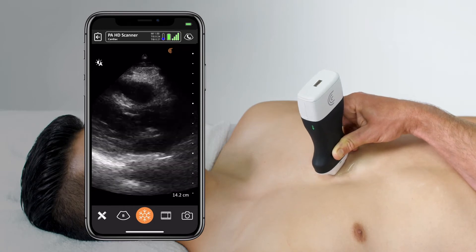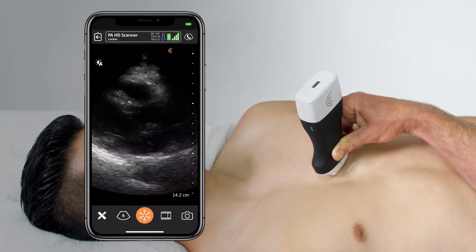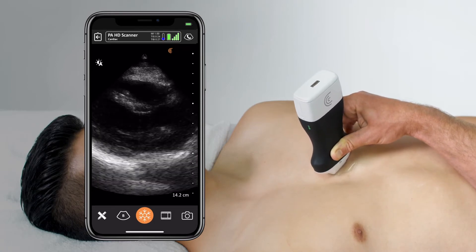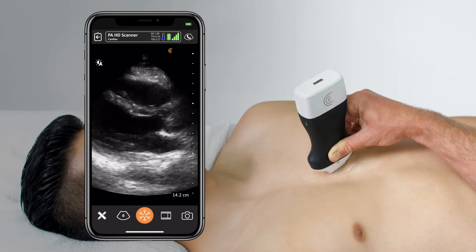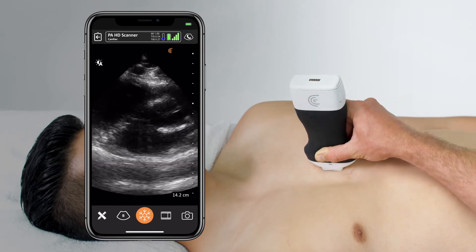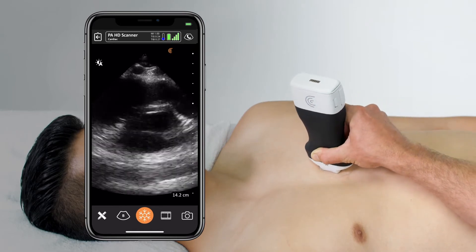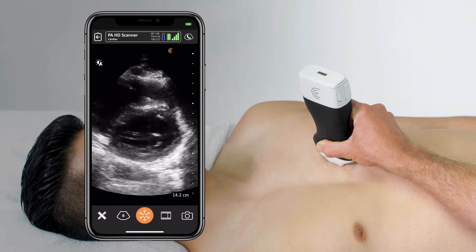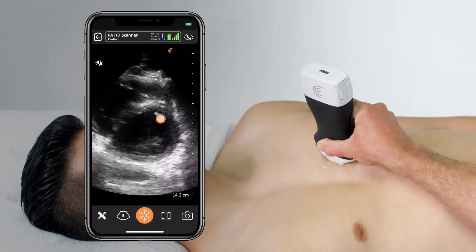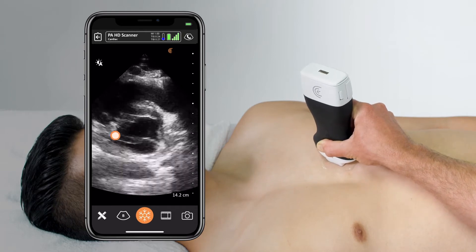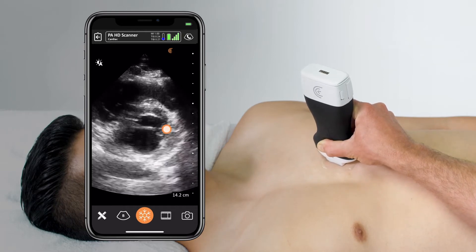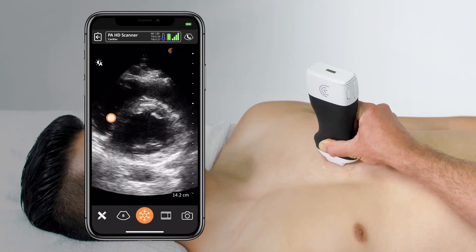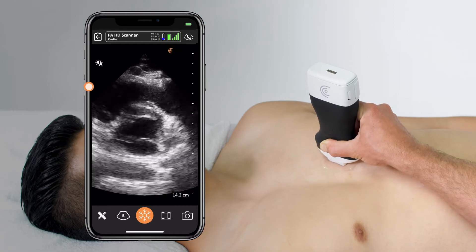To now reach my parasternal short axis, it's just a simple rotation from the same window towards the patient's left shoulder. I'll see the left ventricle come into view as the round donut with the croissant of the right ventricle up on its left.